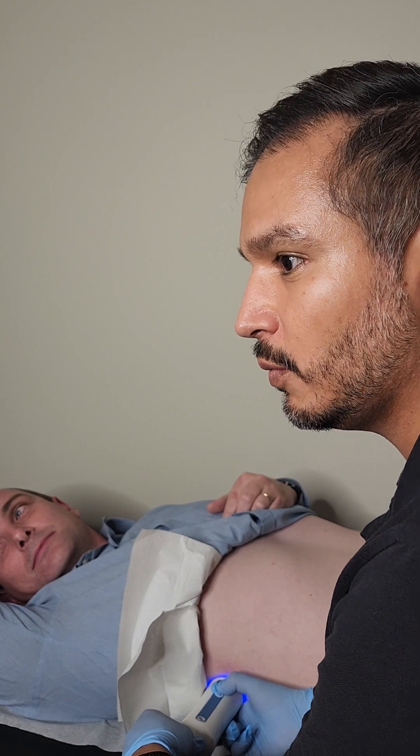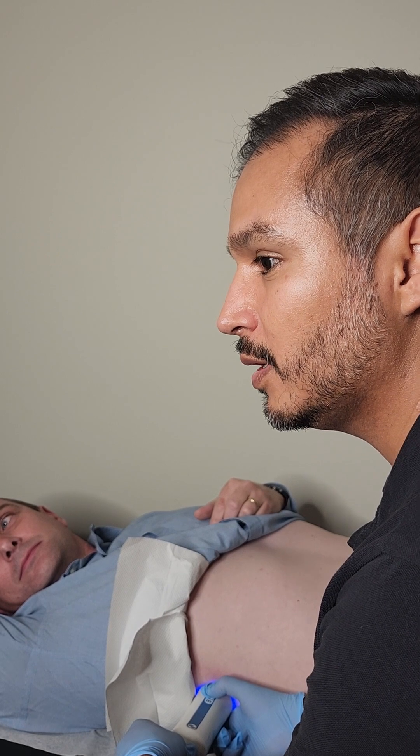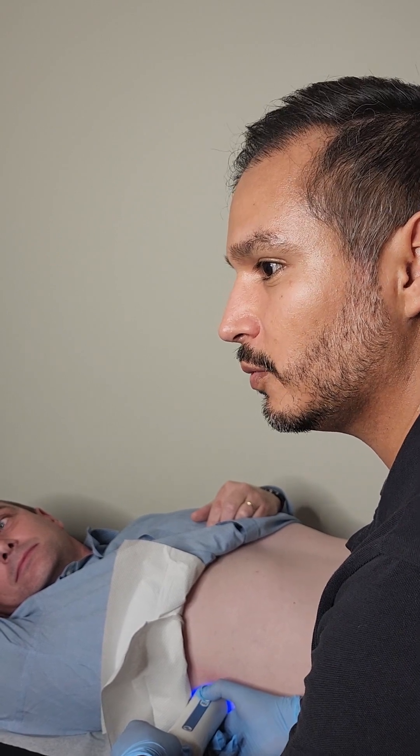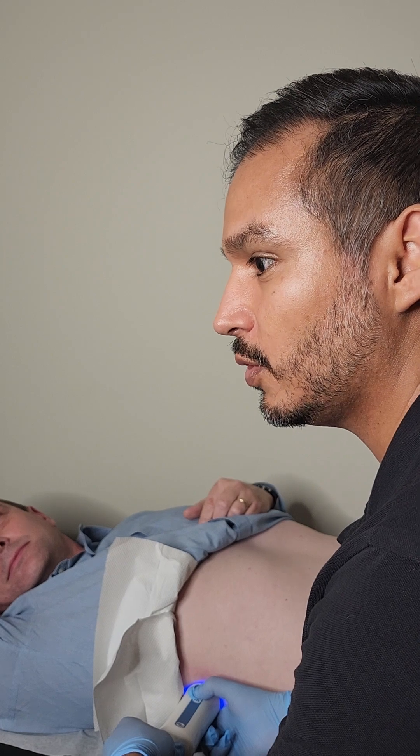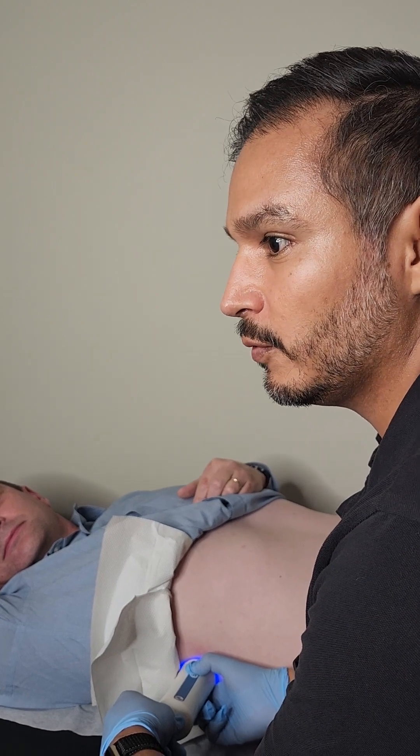And David, what would you like to say to the camera? Well, the FibroScan is not invasive and the cool thing is it does two factors. It measures the density of how much fat is potentially accumulated on the liver, plus it checks to see if there's any stiffness, which gives us a great way to figure out if there's something we potentially have to follow up. Plus it's free, and since we do clinical research, you're able to participate and get a lot of the medical expenses at no cost, and you can keep your records for medical history for your doctor.